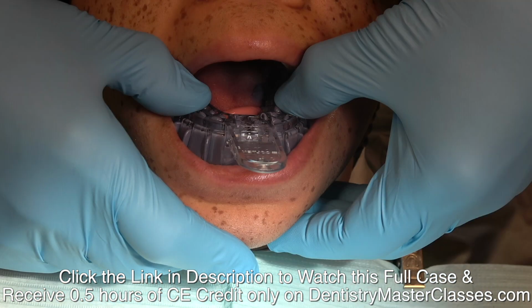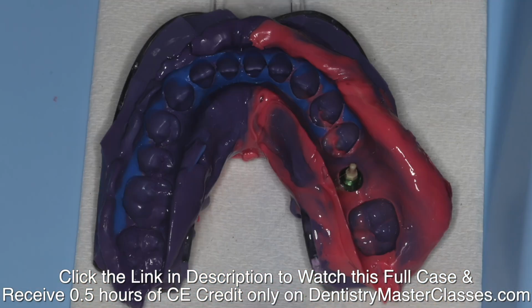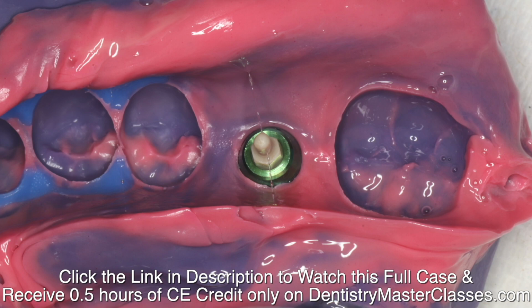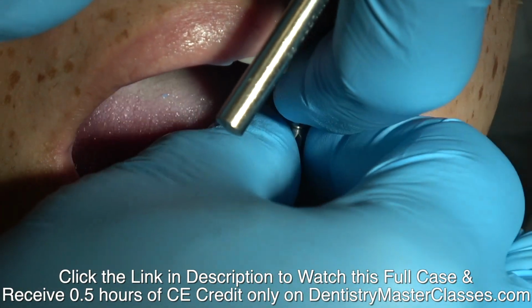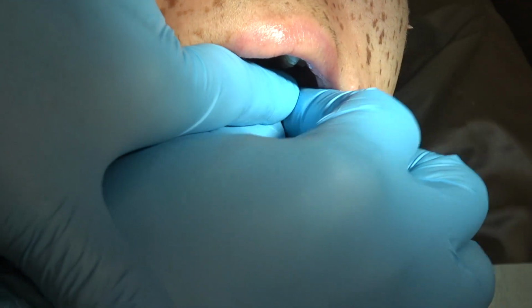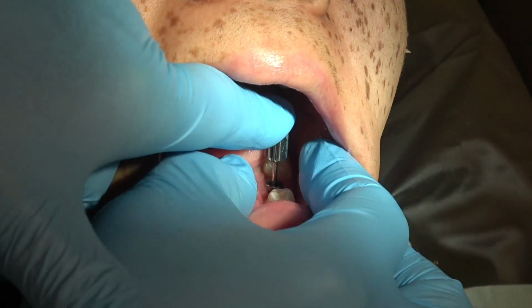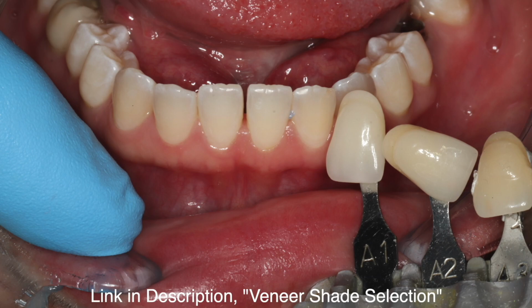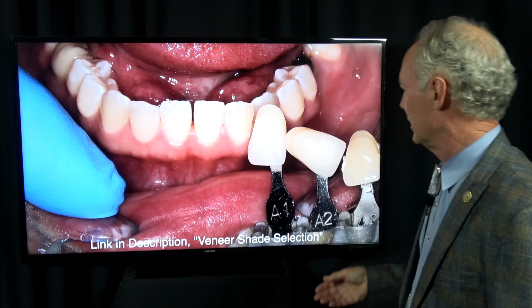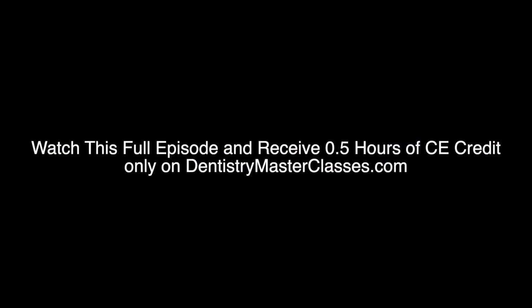Leave this for 5 minutes. You see how accurate that is. Then I'm going to screw the impression coping back in, and the patient's not been anesthetized for any of this, unless they were just really gingivally sensitive, and it gives you a little bit of pressure in the gingival tissue, but there shouldn't be anything of consequence. And so then we'll take a shade, send it to the lab, then here's the crown.